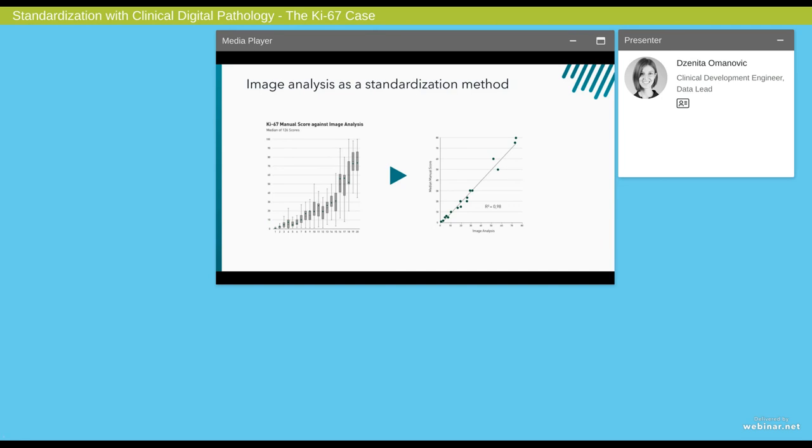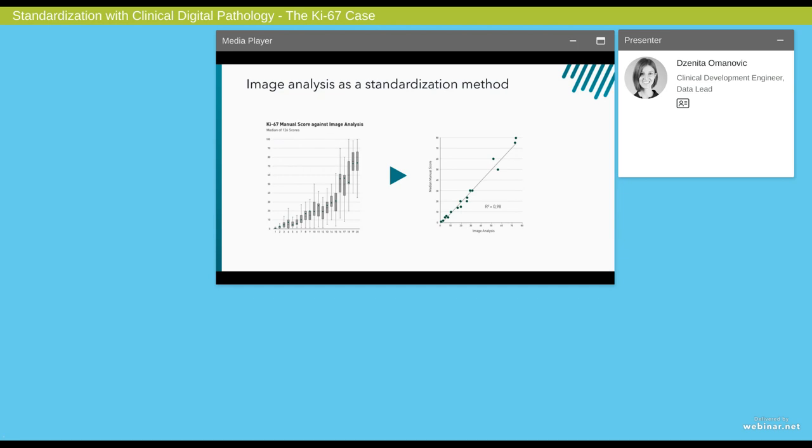Now, one question we asked ourselves when we first realized how difficult it is to assess the KI-67 proliferation index was if image analysis could be a way forward to obtain a standardized and reproducible method for KI-67 assessment. We were so lucky that we got our hands on the TMA cores from the study conducted by Reis-Mosrö and colleagues, and we could therefore analyze the tumor cores with our KI-67 algorithm. To the left, you can see the original manual assessments, and then we have plotted the image analysis results as a green dot on top of the box plots. On the figure to the right, we have plotted the median manual scores and the image analysis results. Interestingly, we see a very high correlation between these two variables, and thus also a potential for image analysis to be used as a standardized method for KI-67 assessment, and also a way to overcome the controversy around the inter and intra variability.